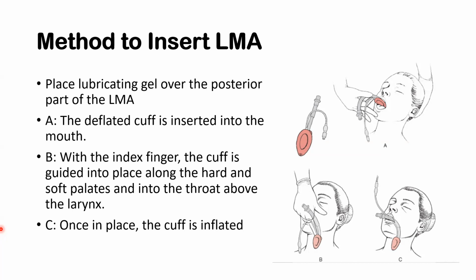Okay, dia blind. Ada soalan? Usually in adult patient, you use size 4 lah. Yang tu yang common size untuk adult. Kalau smaller adult ataupun bigger child, guna size 3 lah. Tapi ingat, ni memang ada tulis punya, kebanyakan berapa kilo saiz apa dan berapa untuk inflate pun akan tulis punya.